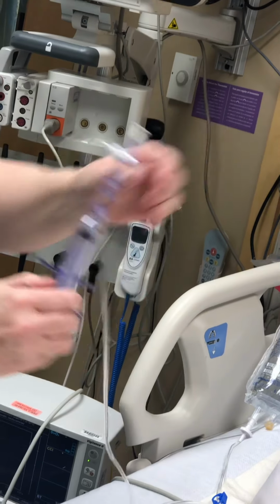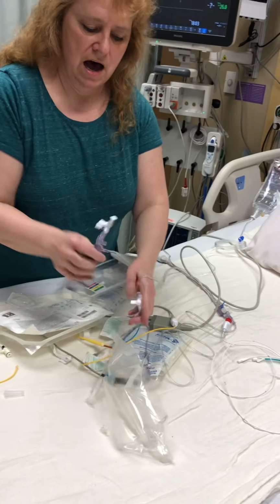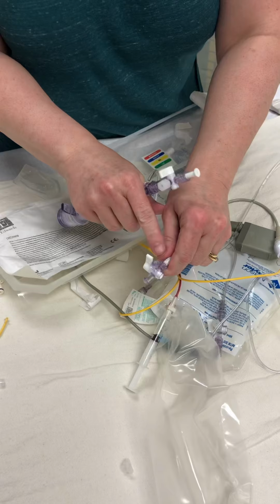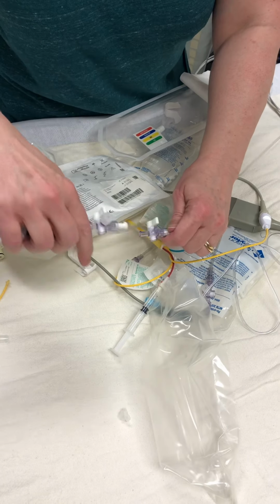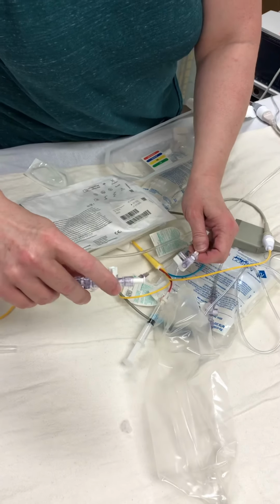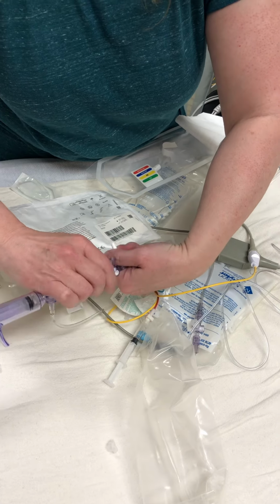Okay. So this is going to go on the end of your swan right here. So right here, this is where you'll have your bridge for your CVP. This is gonna go on the end here. And if you have a maintenance fluid, you're gonna put the maintenance fluid on this stopcock here. So what I'm gonna do is I'm just gonna attach this here.